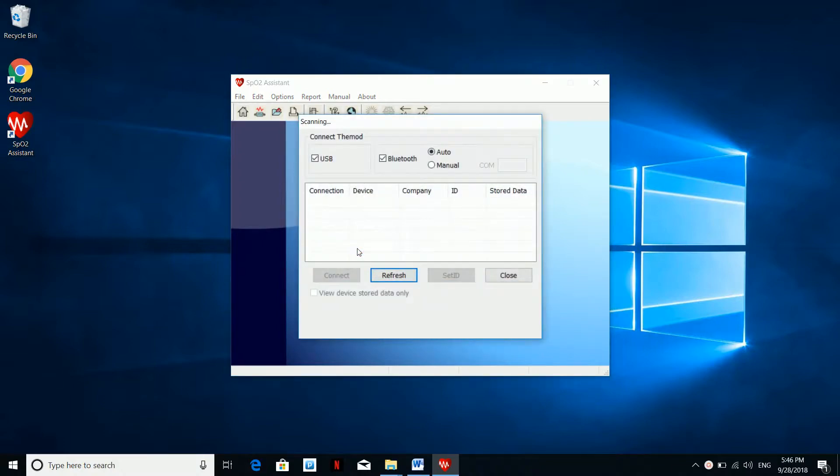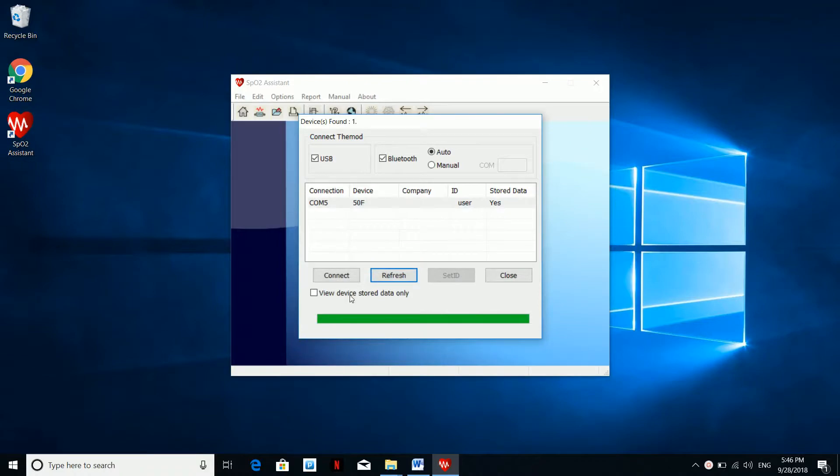Make sure your oximeter is on and the software will automatically find the device name. You can also manually refresh to look for the device.